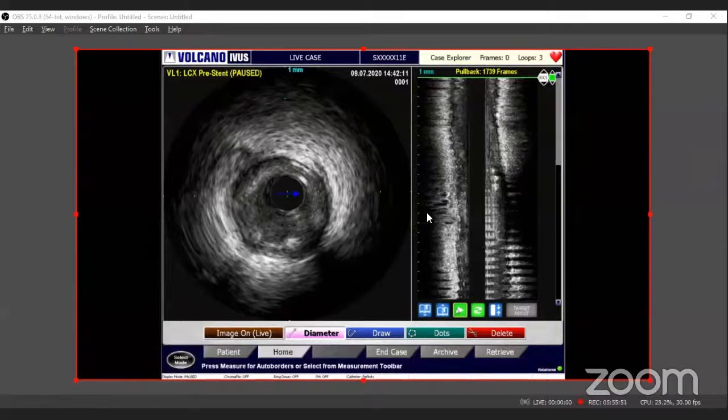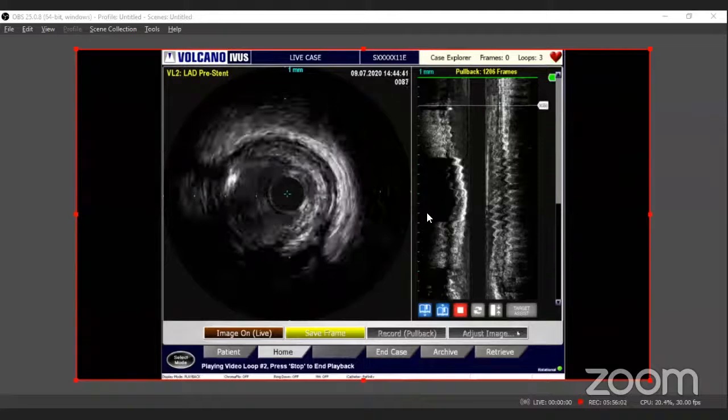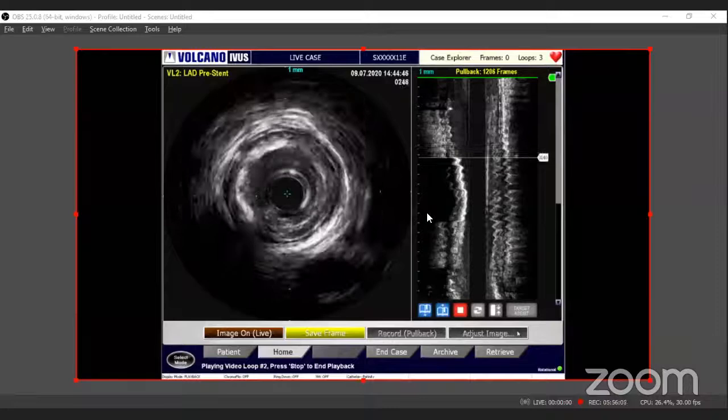Sure. So can we play the IVUS, please? Yeah, show the second pullback. Yeah. So it'd be interesting to see what the IVUS shows for the ostial LAD. Yeah. So this is the pullback from the proximal LAD. It's now in the proximal LAD.